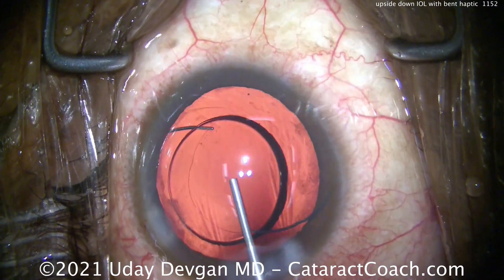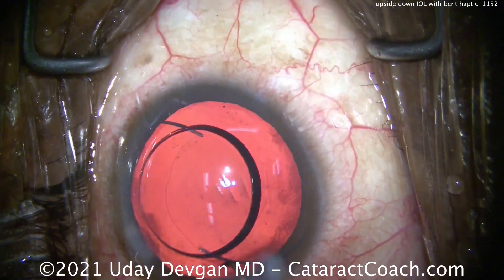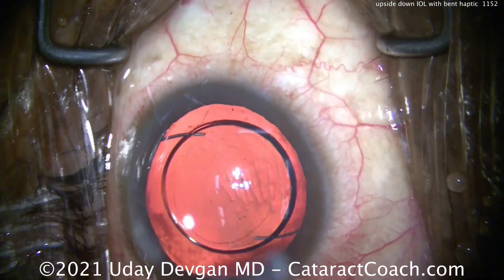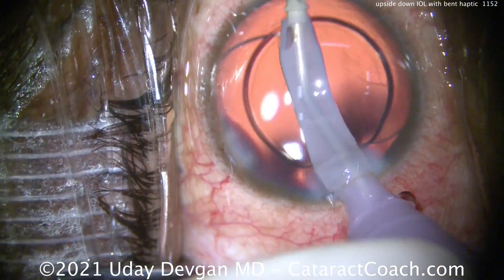Once we get this lens fully dialed in and completely in the capsular bag, you'll see it centers beautifully. Nice-looking rhexis — 5mm rhexis, 6mm optic. Beautiful case.